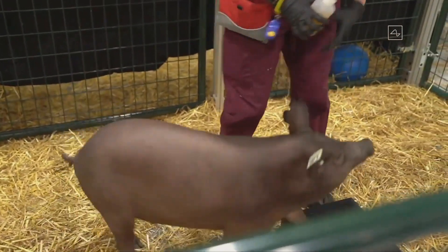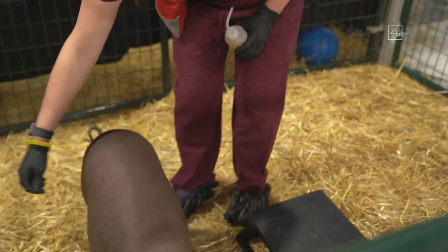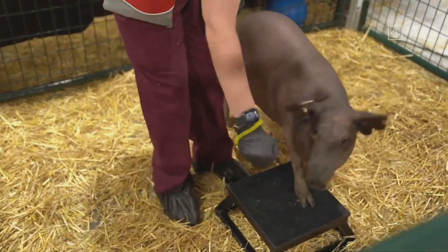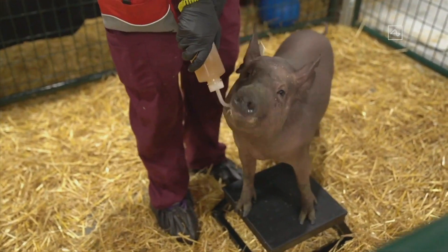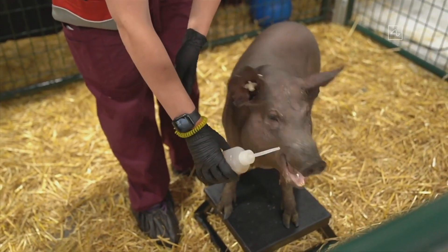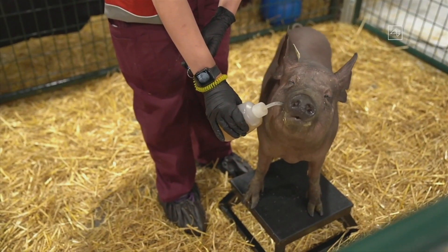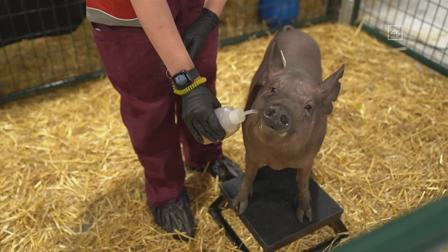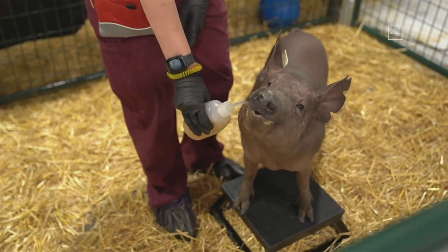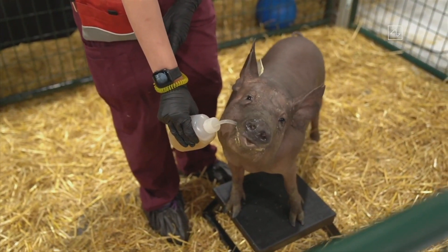Here's Dorothy. In the case of Dorothy, she used to have an implant, and then we removed it. This is a very important thing to demonstrate: reversibility. If you have a Neuralink and then decide you don't want it, or want to get an upgrade, is it removed in such a way that you're still healthy and happy afterwards? Dorothy illustrates that you can put in the Neuralink, remove it, and be healthy, happy, and indistinguishable from a normal pig.